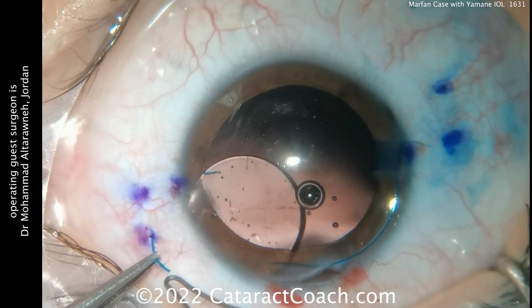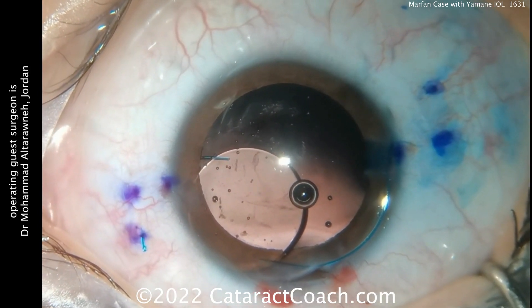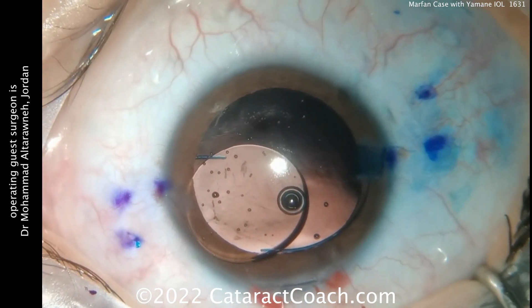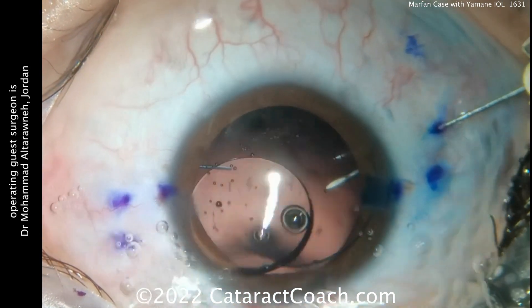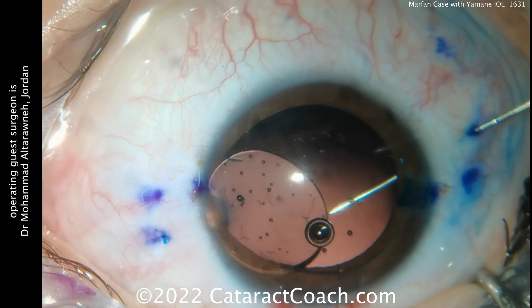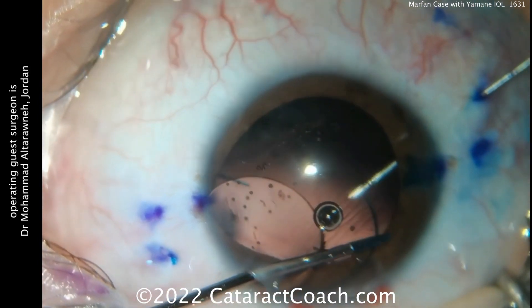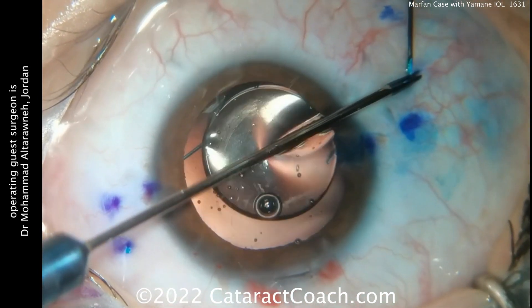The IOL optic is sitting in the angle of the eye. A little cautery here — you don't need too much, just enough. Remember, the goal is to not have that haptic flange under the conjunctiva, but rather within the scleral wall, within that scleral tunnel. Now here again, marking off the needle to gauge how far to pass it. Going in the opposite direction, passing this needle and entering the eye, then feeding that other haptic. Look how the optic is kept up in the anterior chamber. In the standard Yamane technique the whole optic goes deep into the eye into the mid-vitreous — we don't want that here, because the anterior hyaloid face is intact. Keeping that optic up is very important. There's that haptic being put into the needle and pulled out, and now you've got the optic right on the anterior hyaloid face.